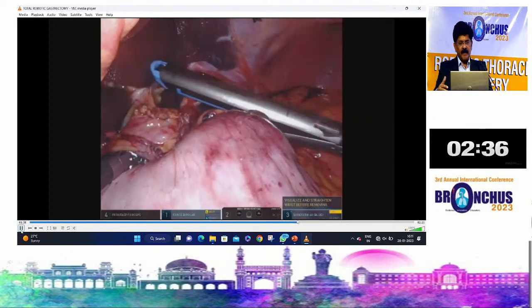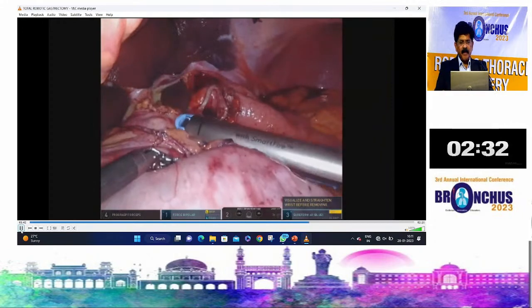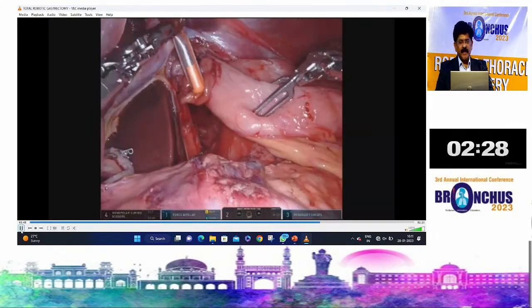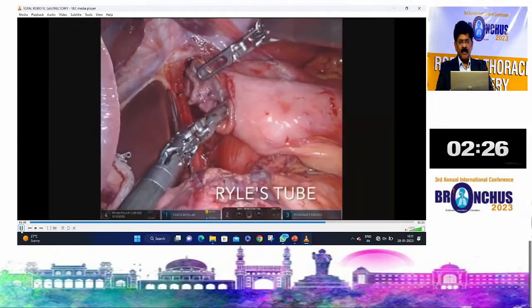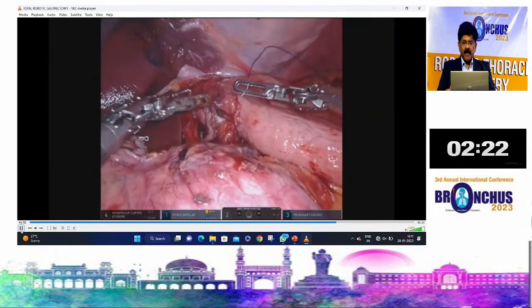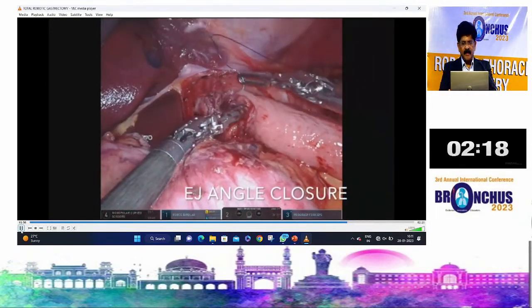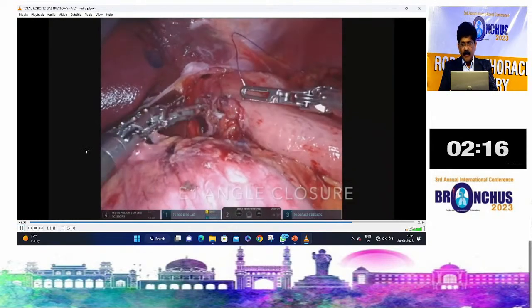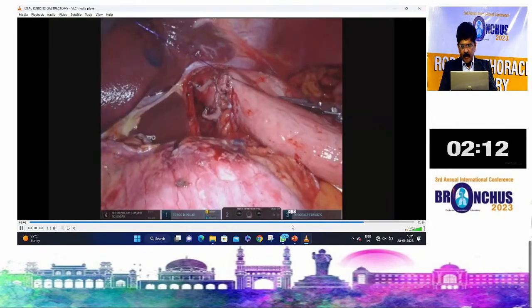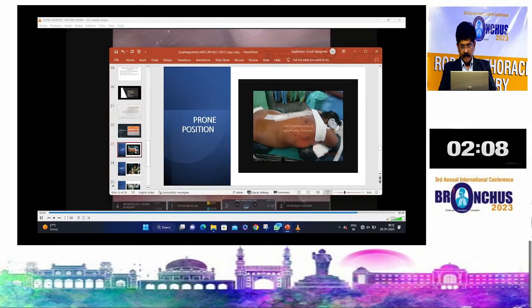The assistant, we need not shout at the assistant that he is not showing properly, and the surgeon himself does the firing. And then the thread can be sutured, because the robotic platform is a beautiful platform to suture. Another instrument costs another 24,000, so I use the bipolar only to suture. So you can see here, it's actually not a needle holder. So these are the different things we can do with the robotic approach.